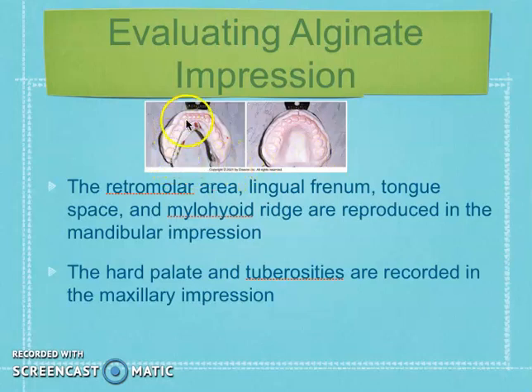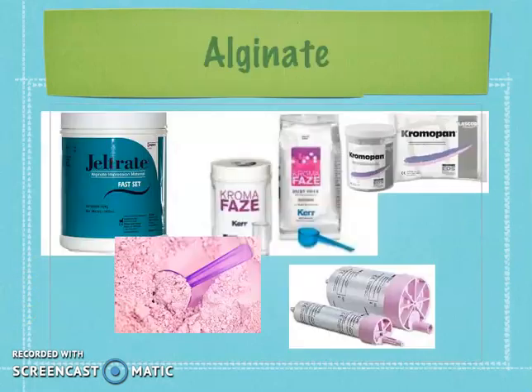Are there any holes in the occlusal or the incisals of the teeth? Any voids? No. Everything looks nice. Are the facials there? Does it look like we hit the teeth anywhere? Do we have any of the trays showing anywhere? No. So these are nice impressions, and this is what you need to learn to evaluate when you look at your impressions.